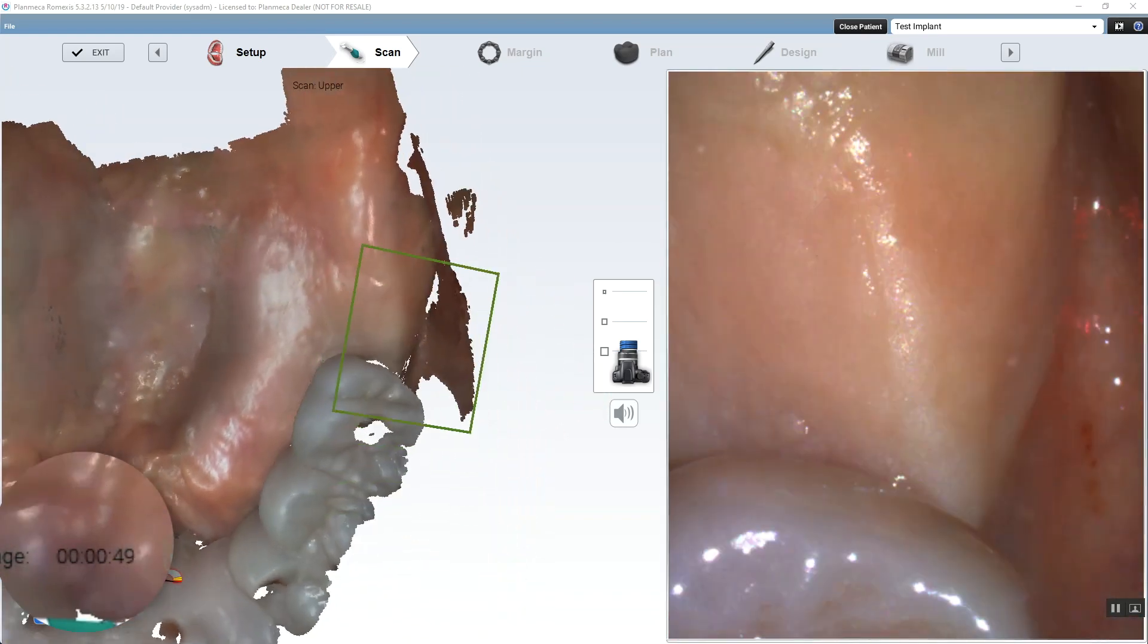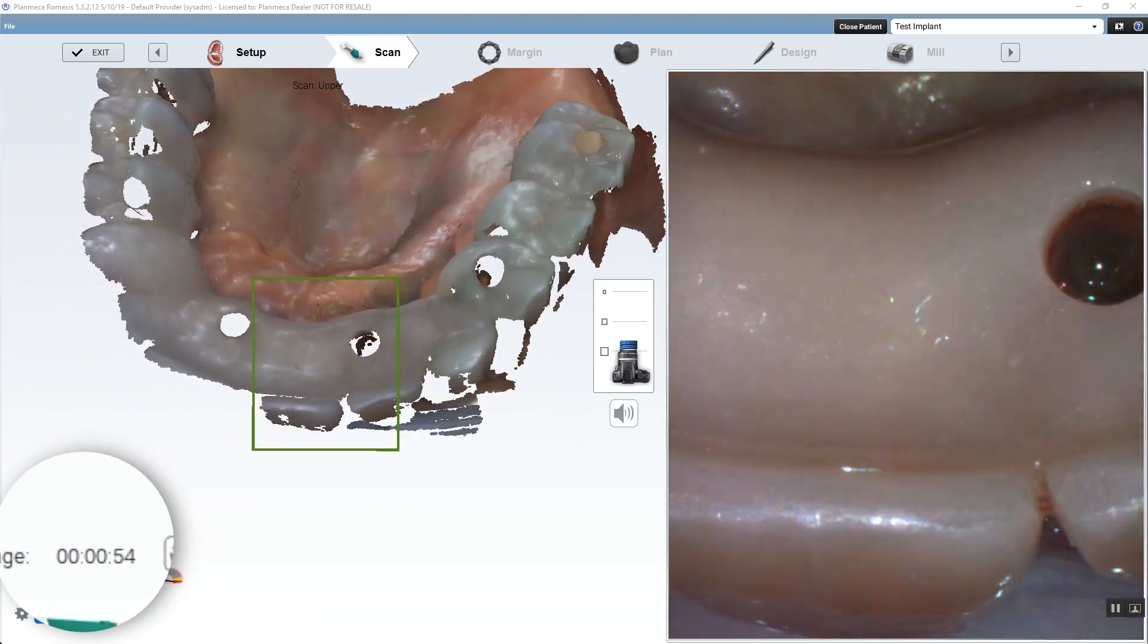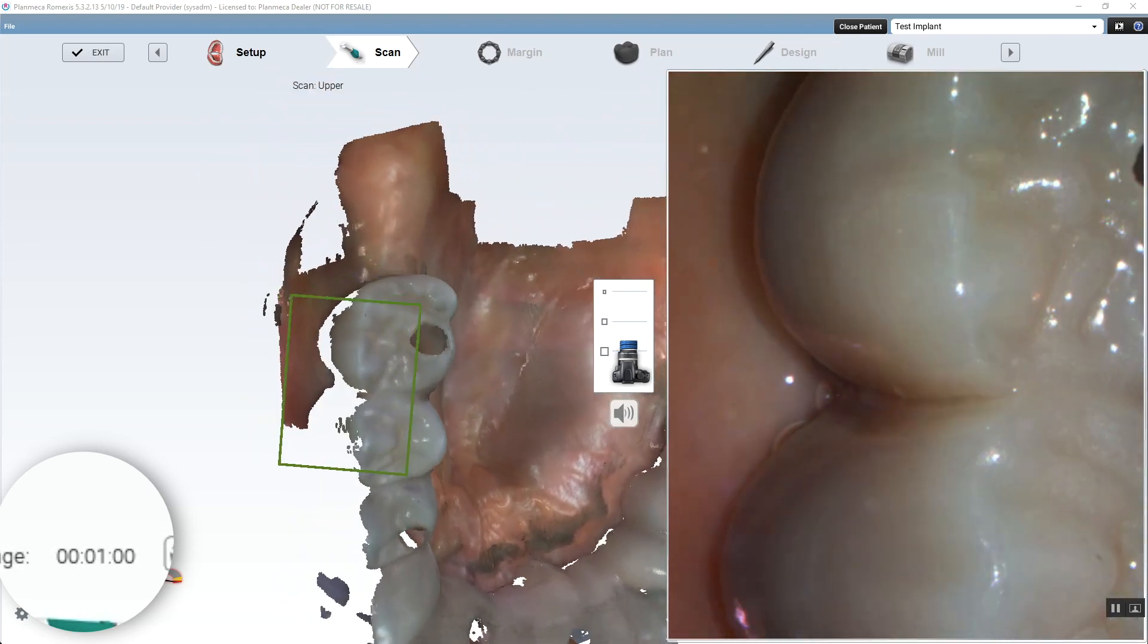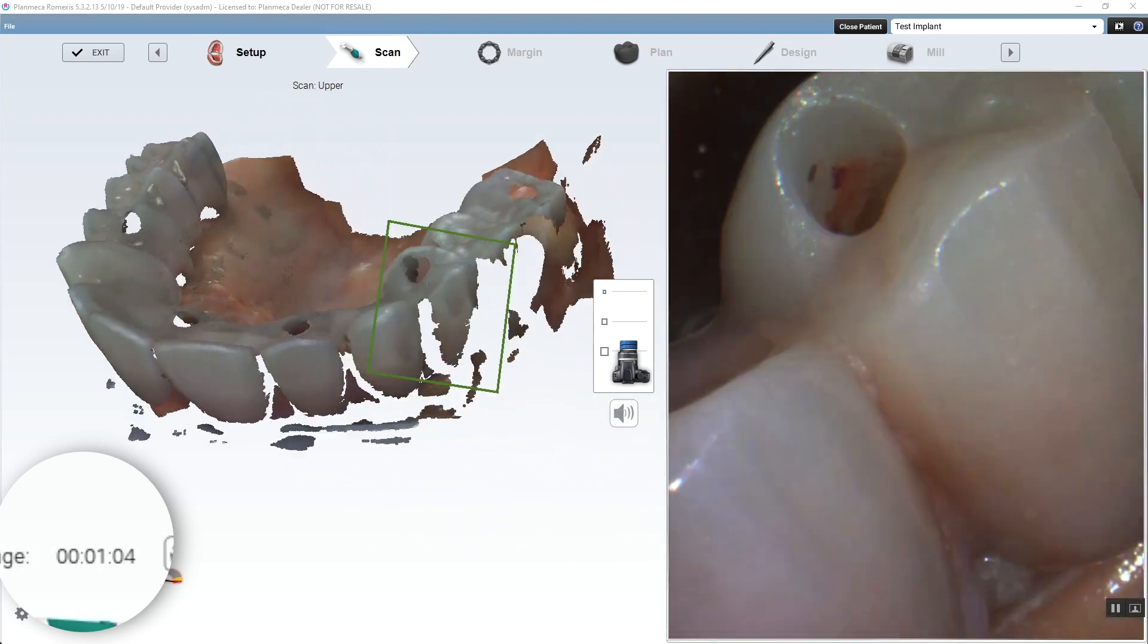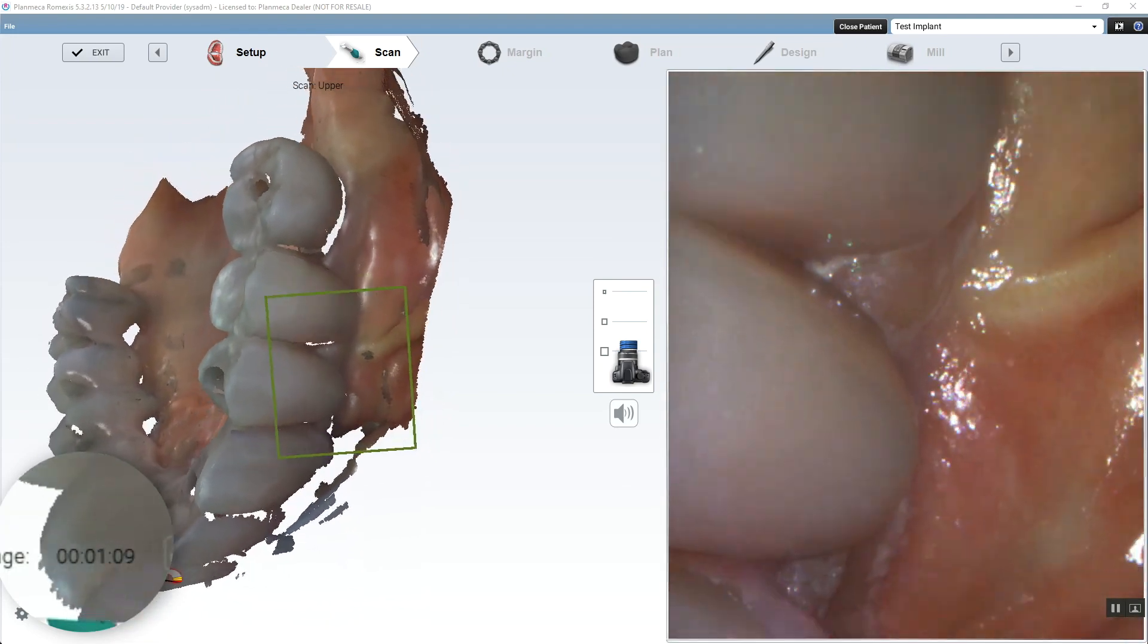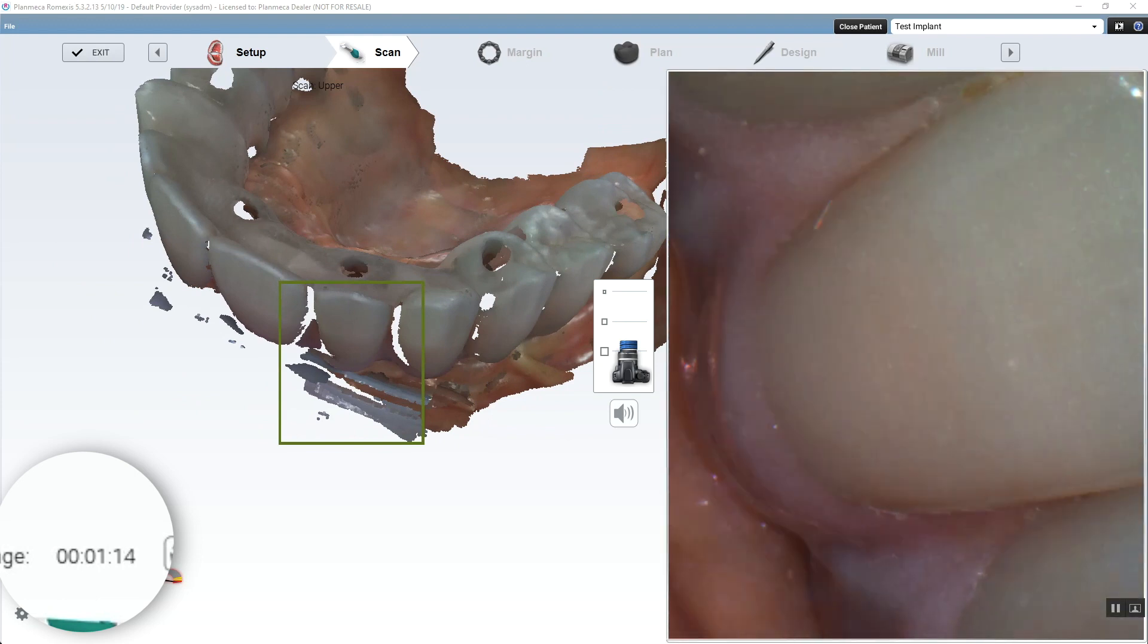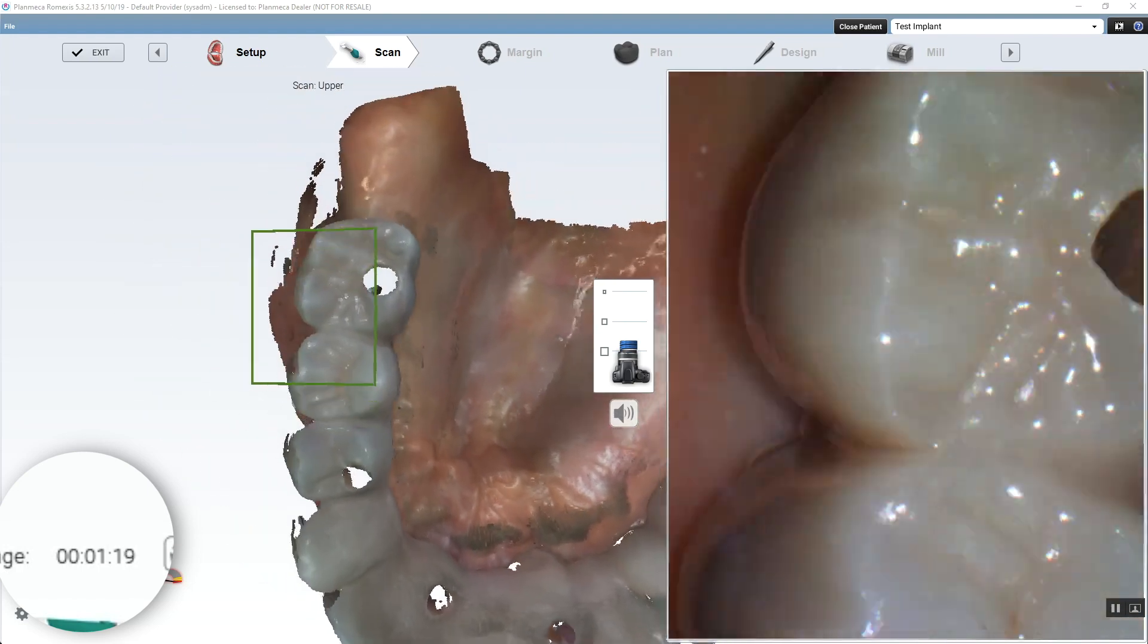I don't know why I'm going all the way so far back, but basically if you're scanning a provisional, and this also will work for any large cases where you need multiple meshes stitched together. Notice how when I go facial that I have some overlap initially. If you are doing this, you definitely want to get some soft tissue apical to the prosthetic, which is kind of hard to do, especially if the patient has a shallow vestibule like this patient.